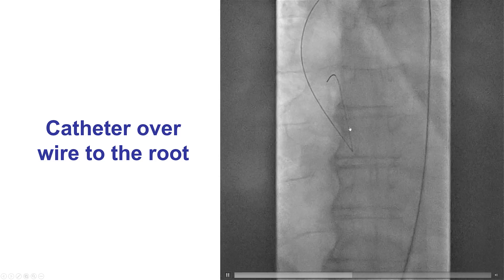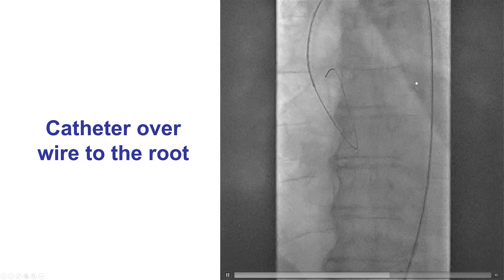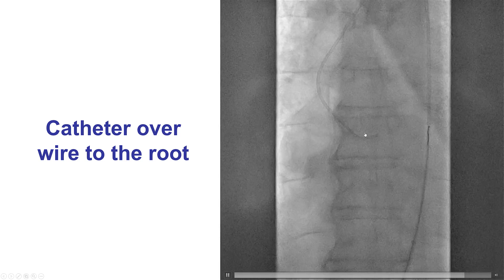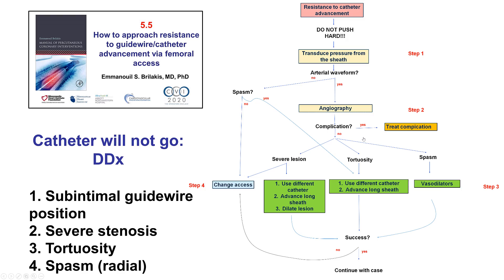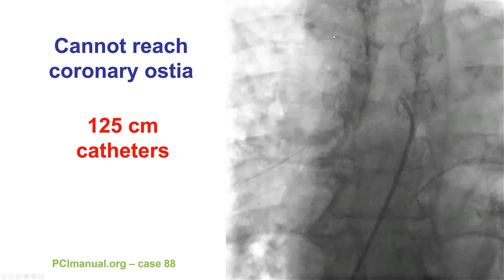The wire comes to the aortic root, then the catheter is advanced over the wire, the wire is removed, and the catheter is now in place. If there is resistance to advancing the catheter, there is a separate video for this, but the key concept is to not push hard. Instead, try to understand the reason for the resistance and solve the problem.